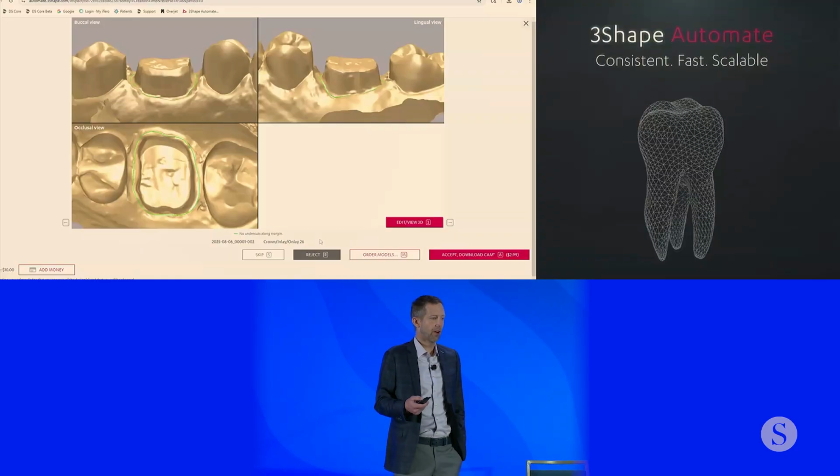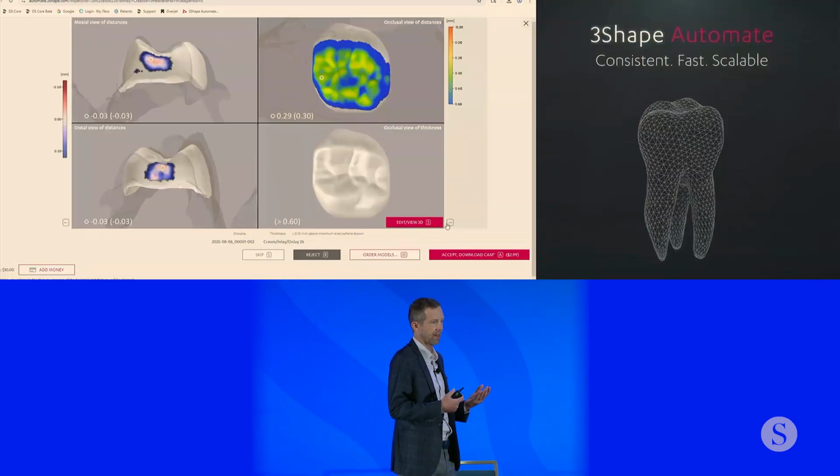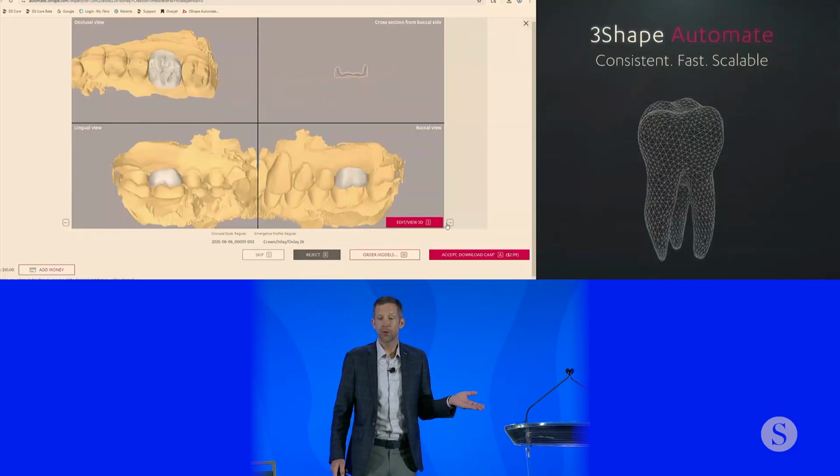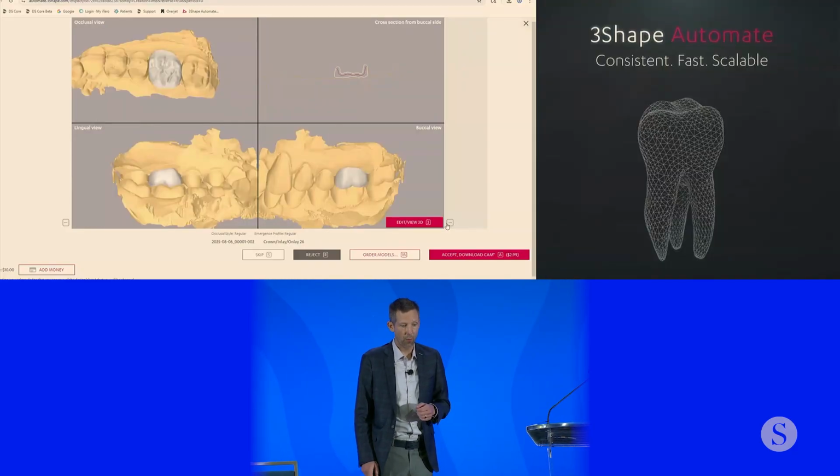So the benefit of these softwares is you don't have to invest in a fancy design software. You don't have to spend the time on training. You can just have them do it for you, and it actually works quite well.